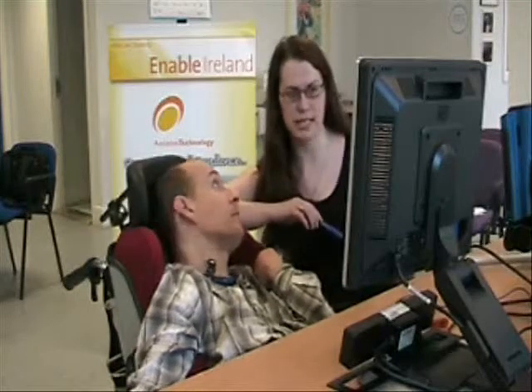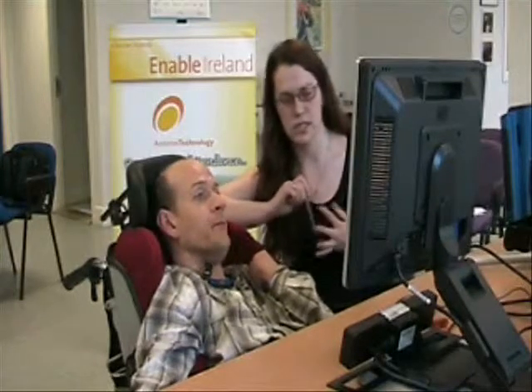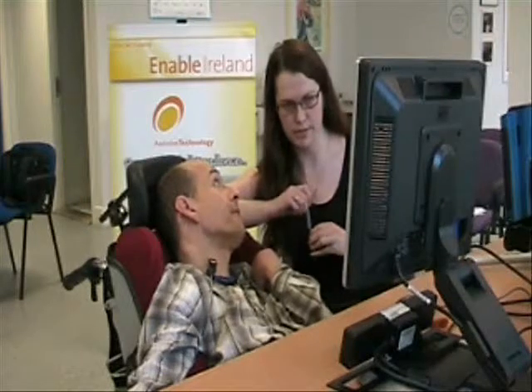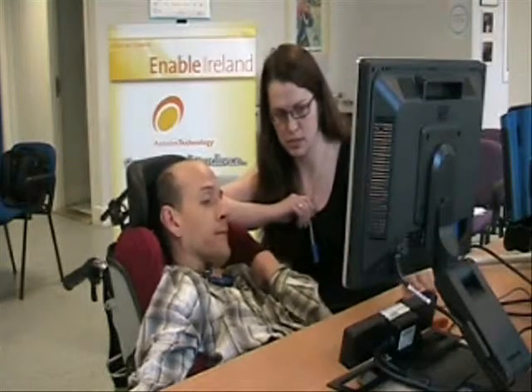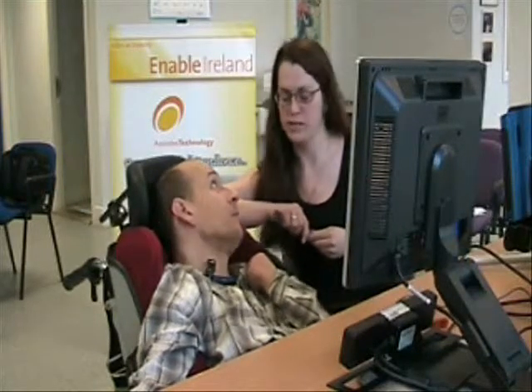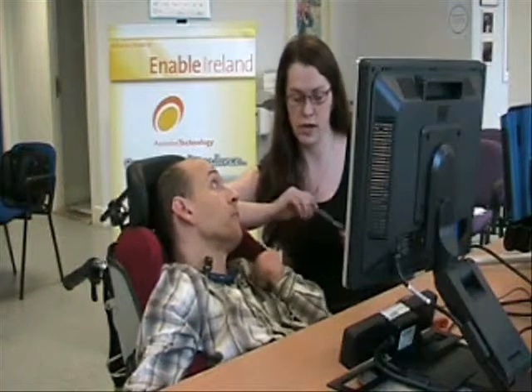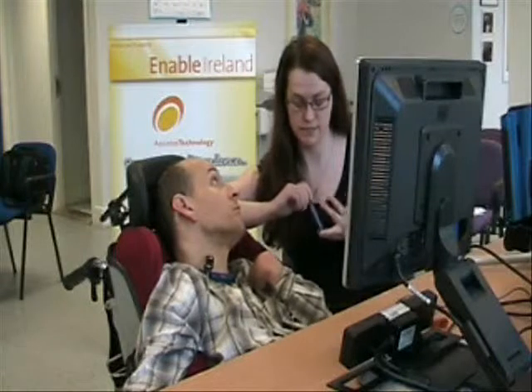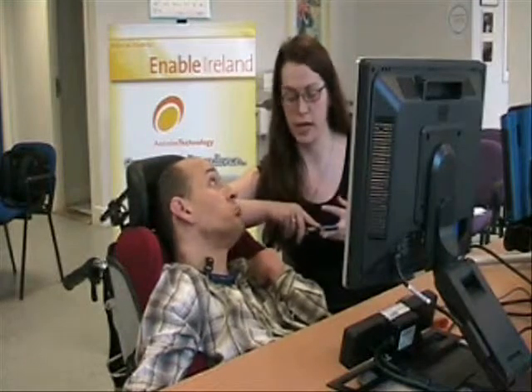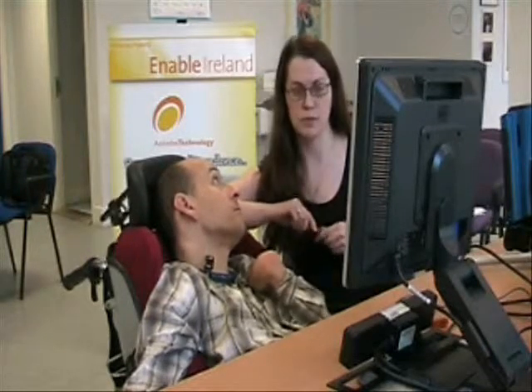What we have this time is basically a standard laptop computer, and on that we've got specialist software and specialist hardware. The specialist hardware is the iTech TM3, which is a separate component positioned just below the screen here, and the camera is facing you. On the screen we're going to have the Grid software, which is computer-controlled software that will allow you to communicate and also activate computer functions such as email, internet access, and control CDs and DVDs as well, among other things.